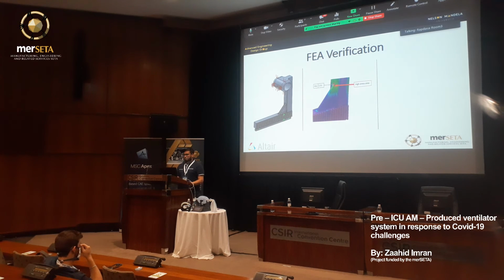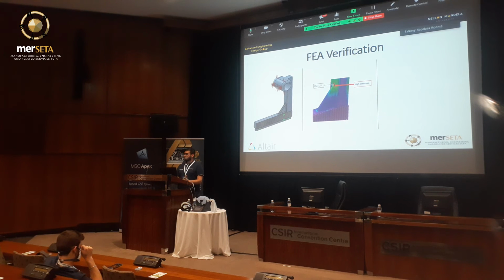Moving on, we can see that studies have proven that a high stress area was confirmed on the rib of the pusher arm. Therefore, a mesh refinement was performed on these filleted areas. A mesh refinement was performed on the rib areas, on top of a global mesh size. A convergence study was also carried out in the high stress zone, and all studies proved to be within a 5% error margin, and thus convergence was assumed to be achieved.